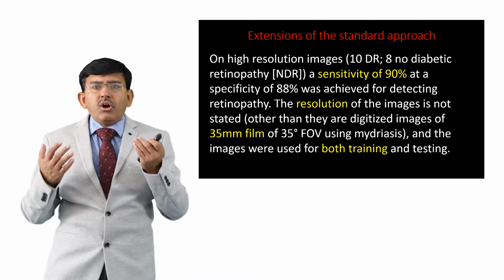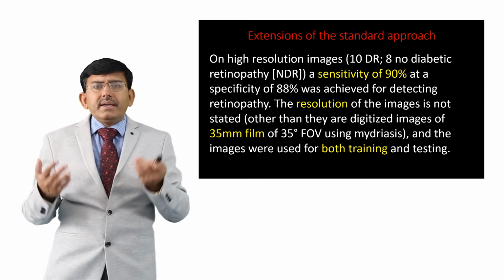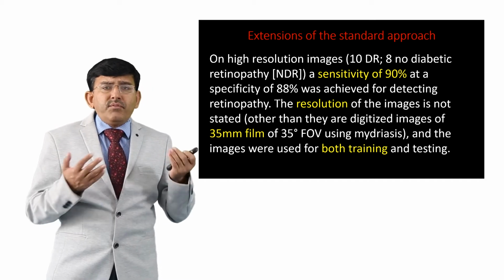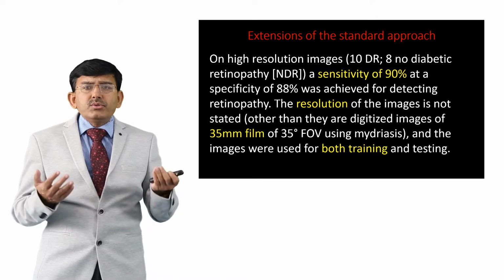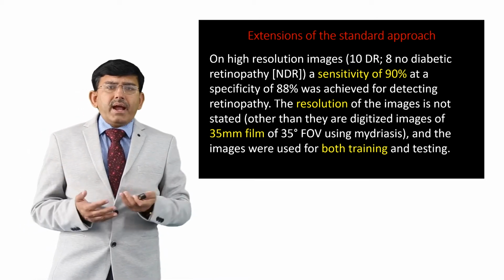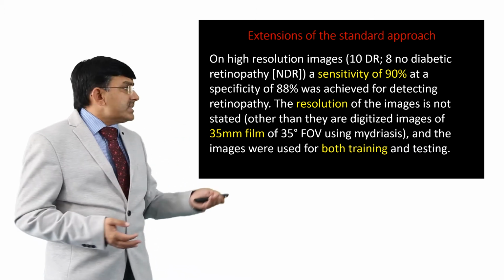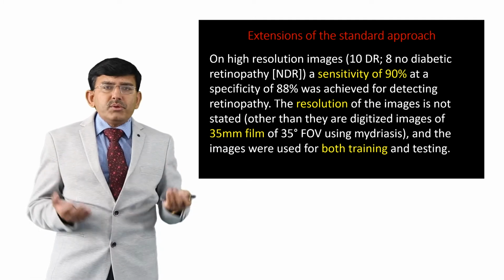The resolution of images is not stated, other than they are digitized images of 35 mm film of 35-degree field of view using mydriasis, and the images were used for both the training process and the testing process of soft computing.